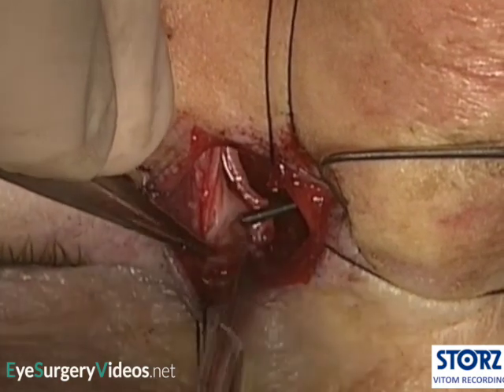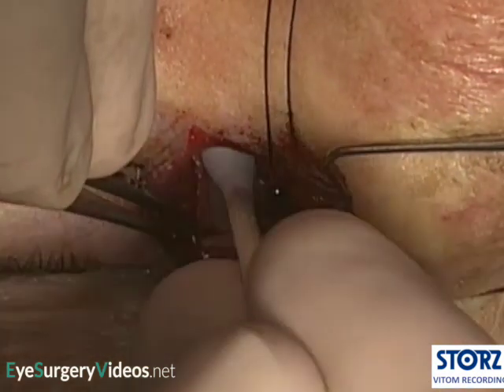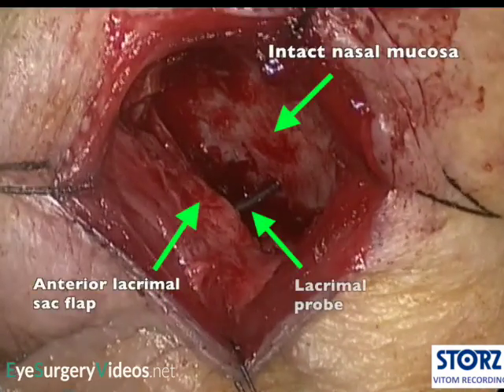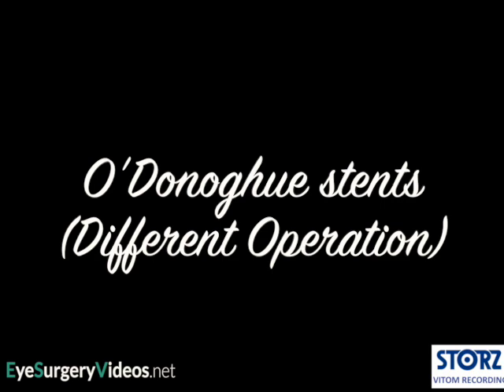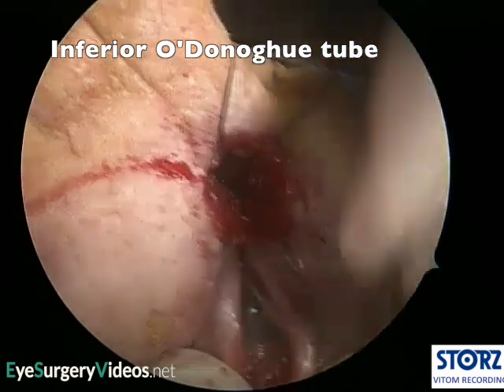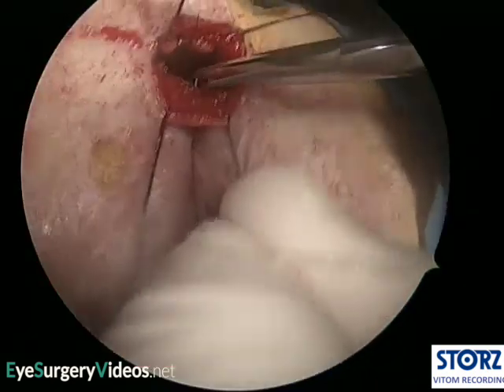In this operation, nasolacrimal stents are not being used. They do not increase the likelihood of success in cases of nasolacrimal duct obstruction. We do use them in cases of canalicular disease or if the canaliculus feels tight or abnormal during intraoperative probing. Currently, it is unknown if stenting improves the success rate in cases of functional delay or obstruction.